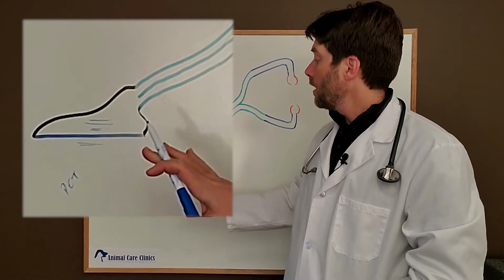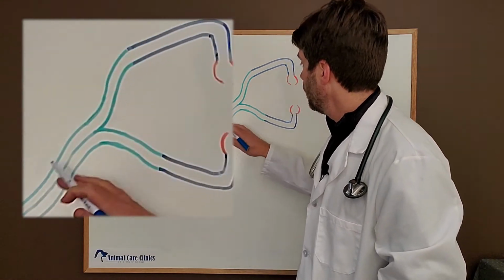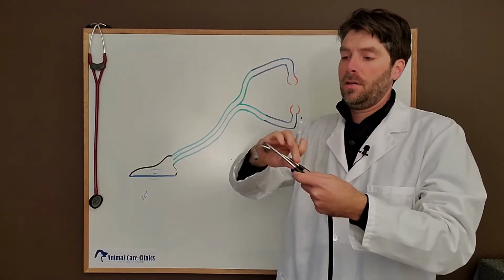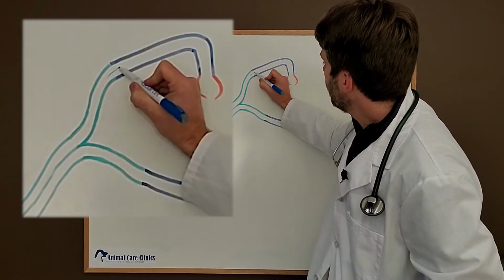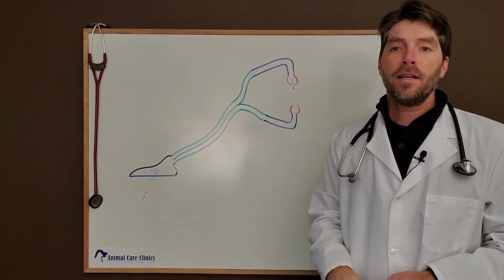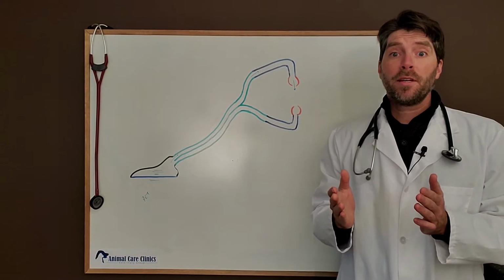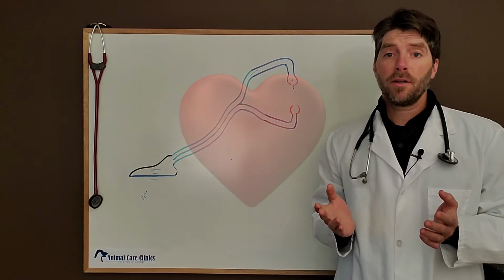And then they just follow the hollow tubes through here up into the metal binaural, which allows the tubes to bend so they can go into our ears, just like you see here. Up, up, up. And then out through the earpieces and into our ears where we hear the sound, whatever it may be, heartbeat, lung sounds, and whatnot. So now that we know how a stethoscope works, what are we actually listening to when we listen to your pet? First, we'll start with heart.